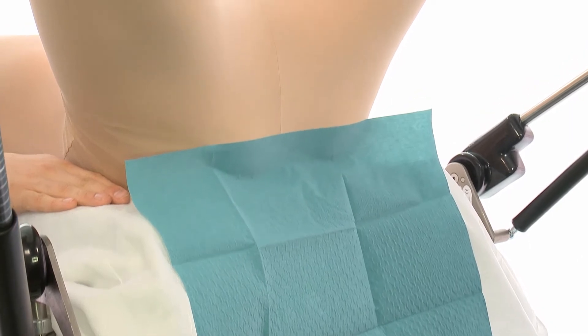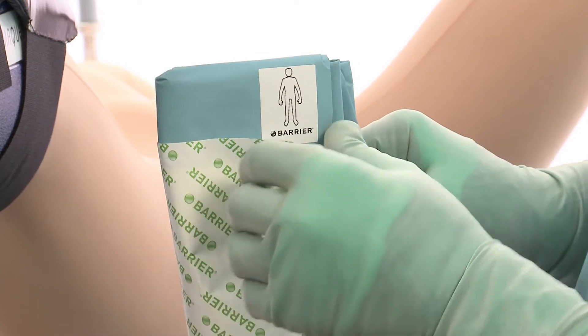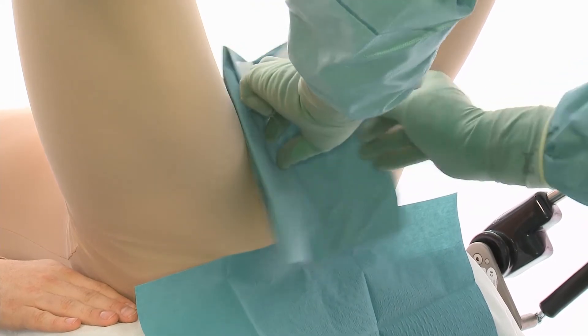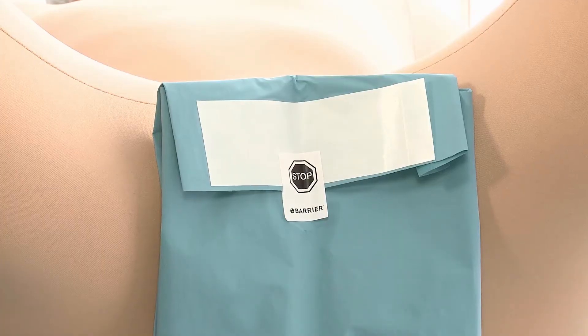Note the direction of the pictogram on the perineal aperture drape. Remove the release paper and securely place the drape on the patient. Leave the drape closed.